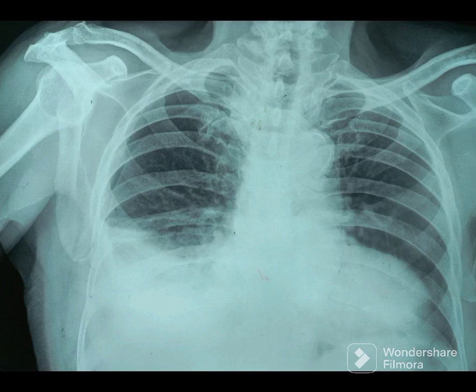Welcome to chest X-ray mastery. You will be provided 15 seconds to look at the displayed chest X-ray and make your impression. At the end we will provide key findings and diagnosis. Your time starts now.